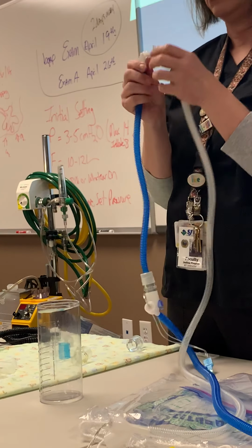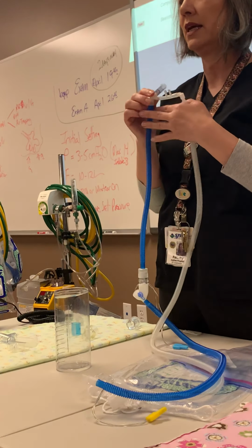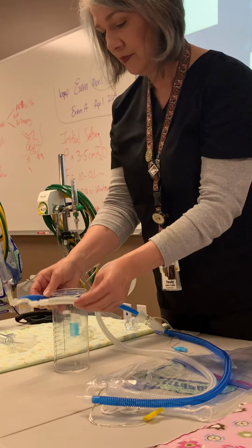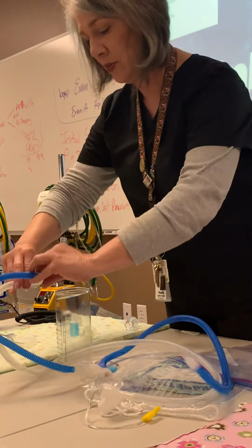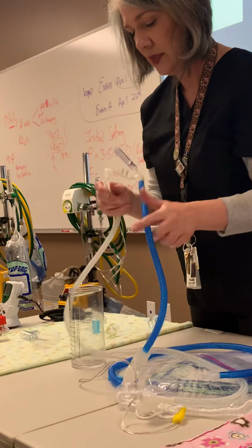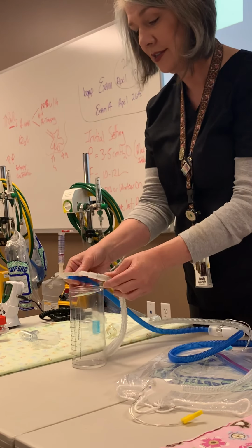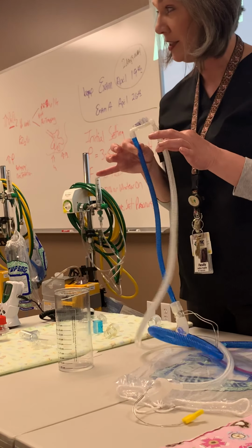Next is your headgear or your bonnet. I don't have headgear and bonnet in here. Headgear and bonnet looks like a beanie. Why do you need headgear? I'm going to use this as baby's head. Baby will have the prongs in their nose, and you're going to have to connect the tubing to hold the nares stable. The bonnet helps keep these two along the sides of the head.